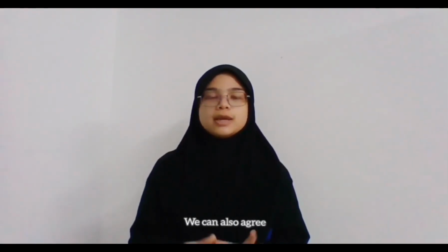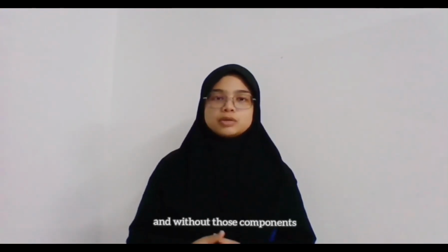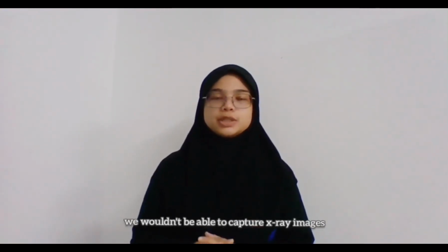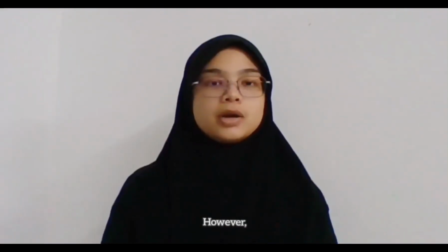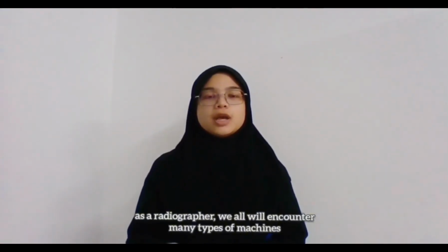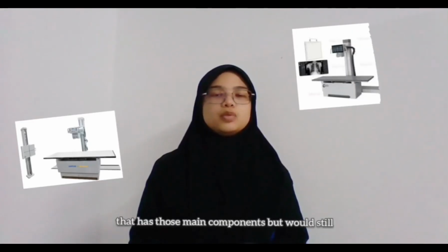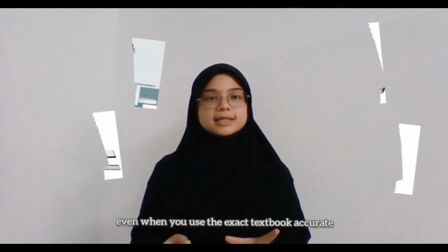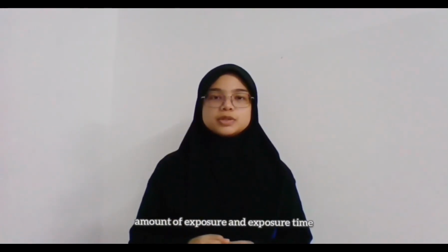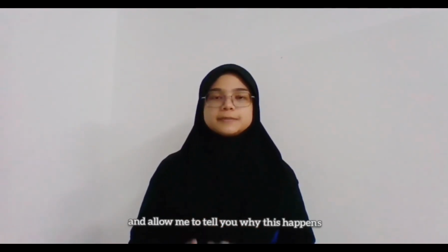We can also agree that those things are the fundamentals of a general radiography machine, and without those components, we wouldn't be able to capture X-ray images and help doctors make an accurate diagnosis. However, as a radiographer, you will encounter many types of machines that have those main components but will still produce different image results, even when you use the exact textbook-accurate amount of exposure and exposure time. Now, this is a very common thing to experience, and allow me to tell you why this happens.